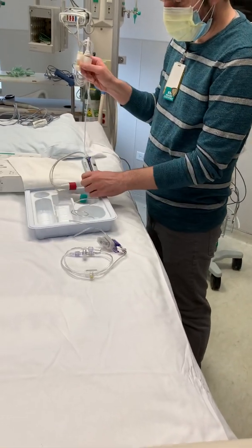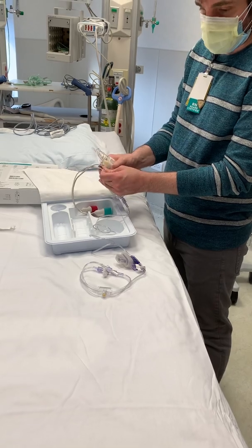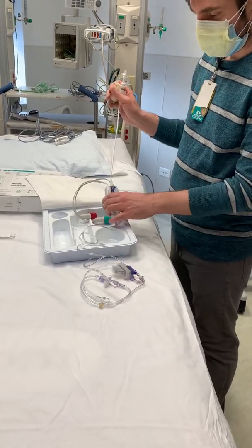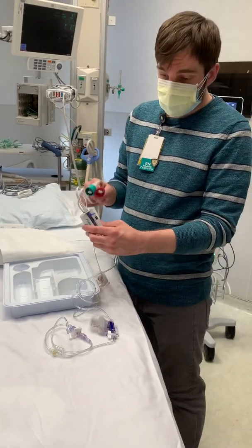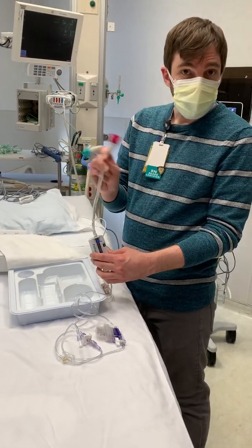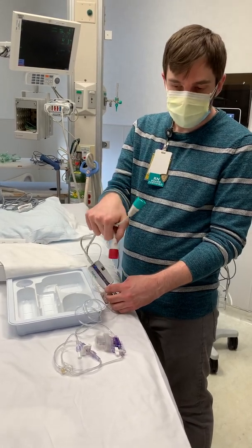You would spike this, pump up your pressure bag, and prime your tubing until it gets to the end — that's step number one. The thing that's different about this is your transducer and this connector. These are different because this is what is compatible with the FlowTrack.